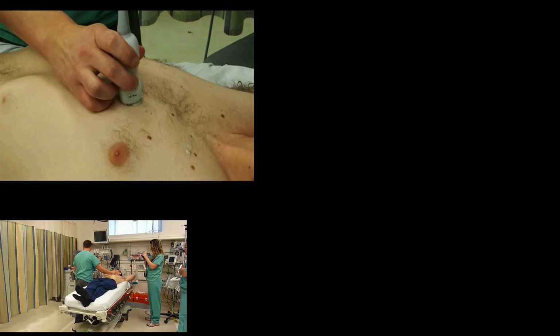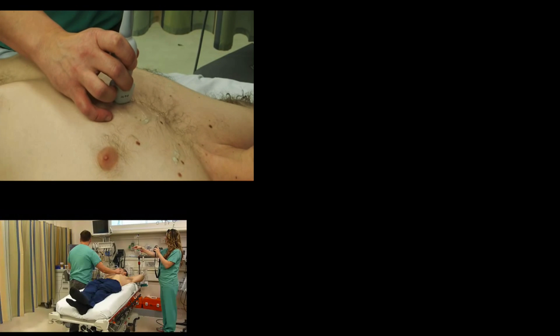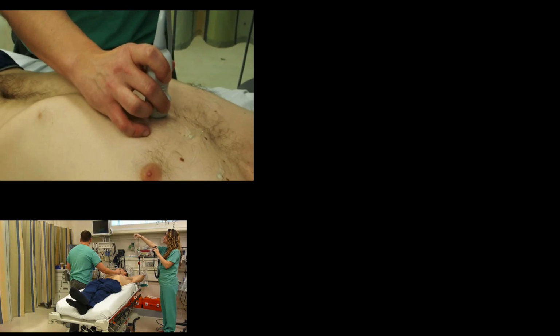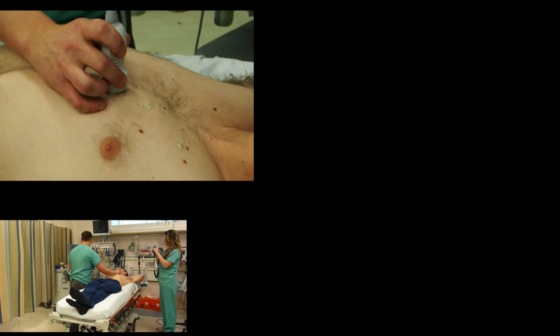Placing the probe just left of the sternal border in the 4th and 5th intercostal space, we're going to try to shoot in between the ribs and point the indicator towards the patient's left hip. By doing this, we're going to get a long axis view of the heart. Notice in the view the apex is at the left of the screen, whereas the root of the heart is on the right of the screen.